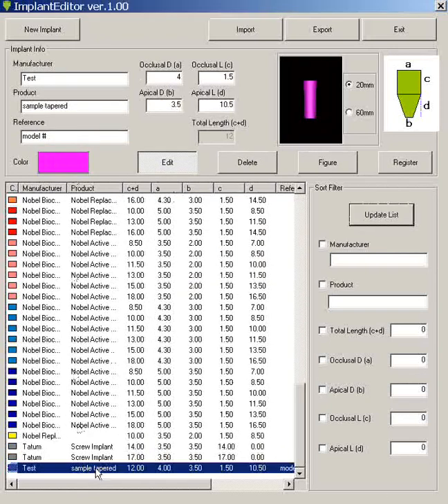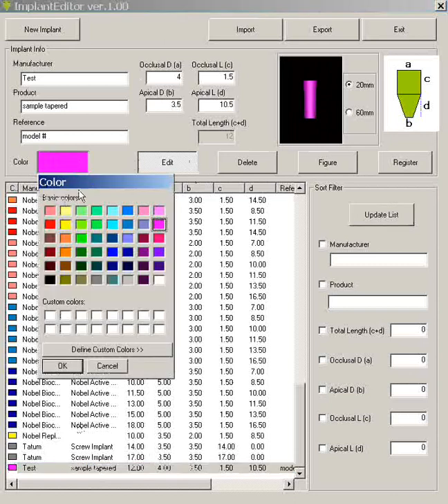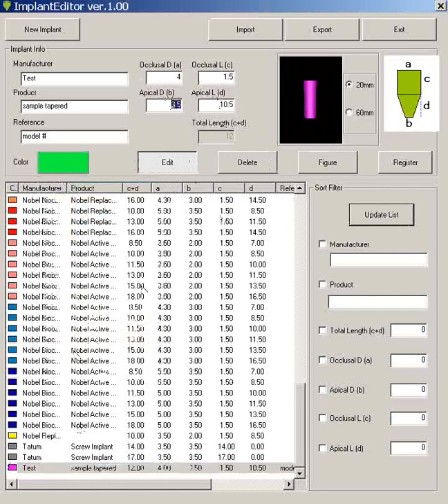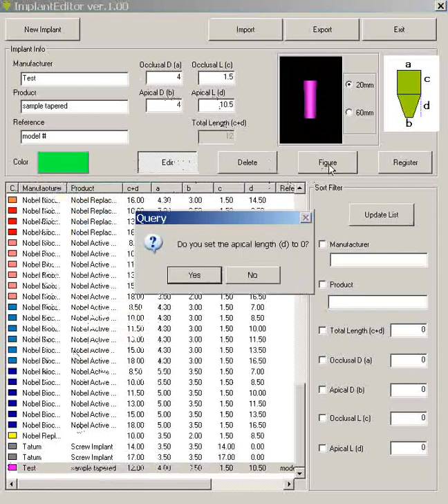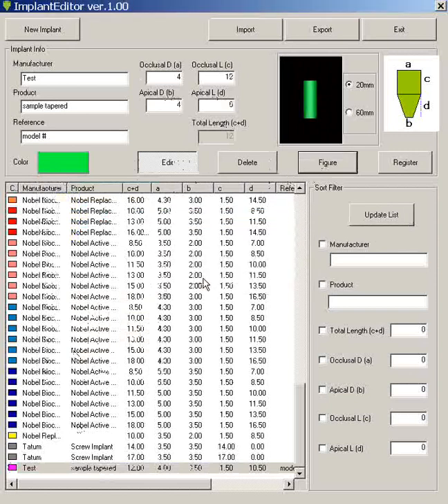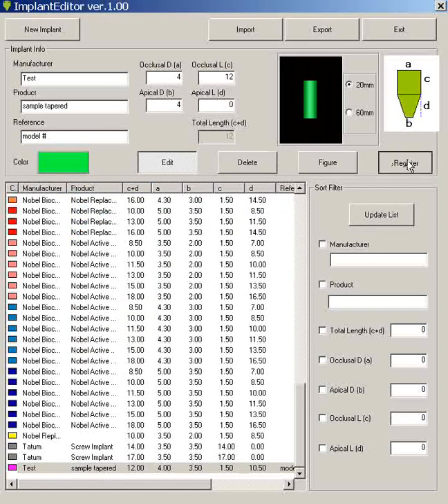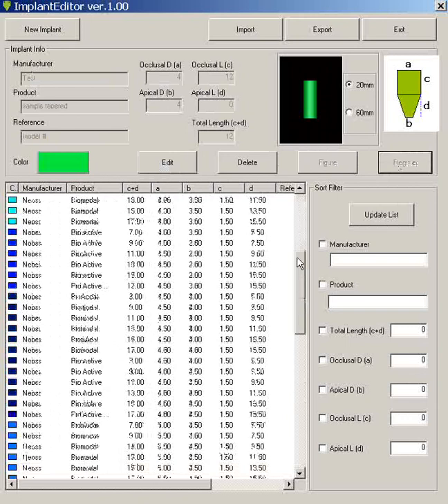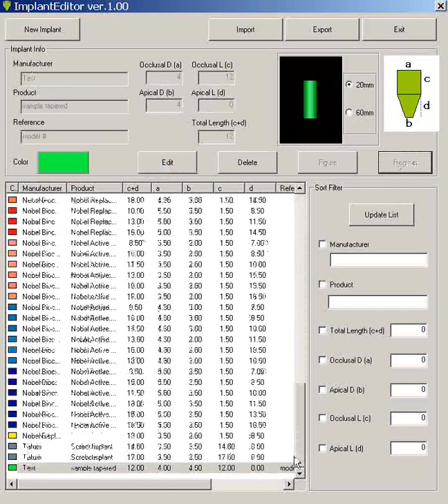Pick the particular implant, click on edit. You could change the color, change to a different color if you wish. You could change the apical diameter, let's make it four. And then we can hit figure and then we can hit register. And then we have the same implant but we just changed the parameters a little bit through the edit feature.